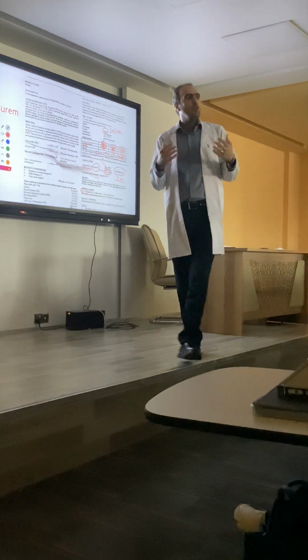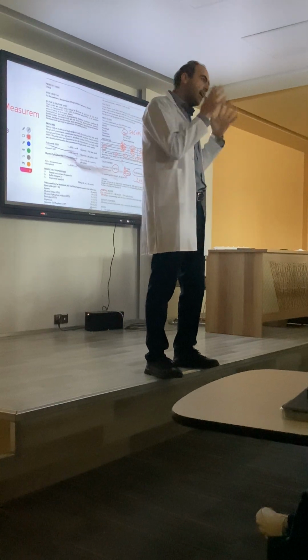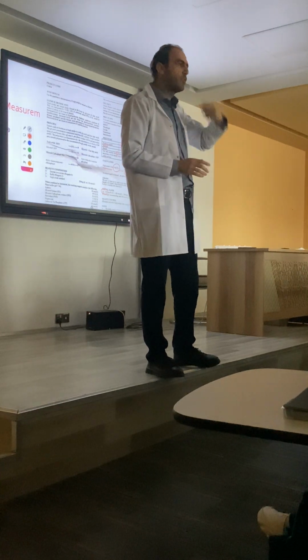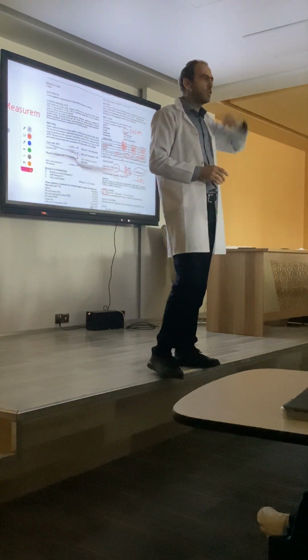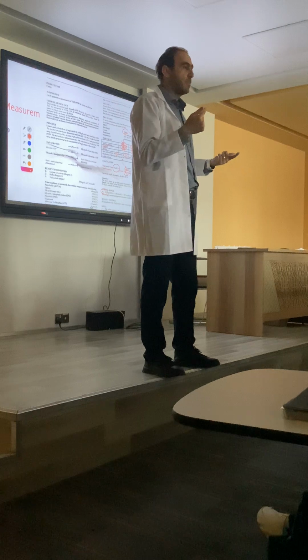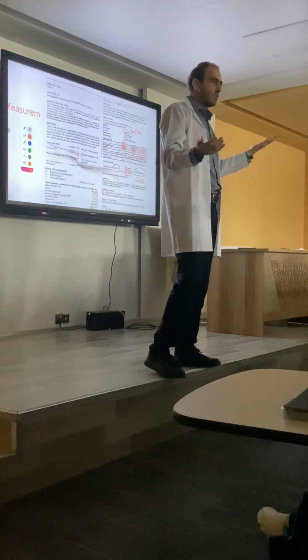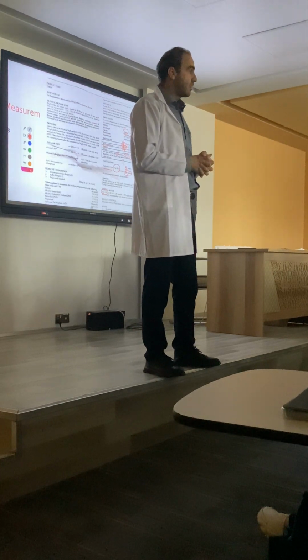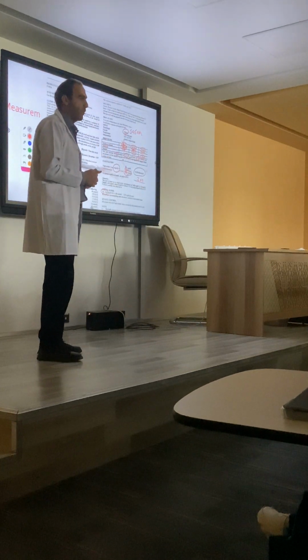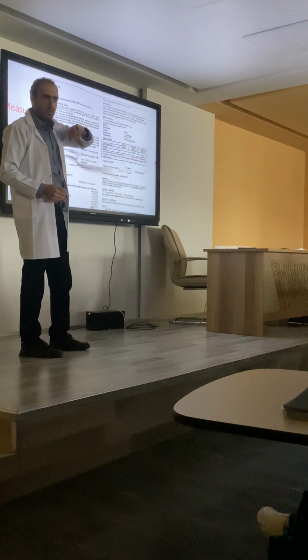Actually, in the lab, we do all these tests by machine, automatically. We always have to check the result, and if it is out of the reference range, we have to recheck it. We call it delta check, two or three times. We have to look at the previous data of this patient. If it was similar to the previous, it's good. But if it wasn't similar, we have to find the reason. Maybe this time has a problem, maybe our result is wrong, and we should find that out. So that's the second experiment, triglyceride measurement, and it's finished.